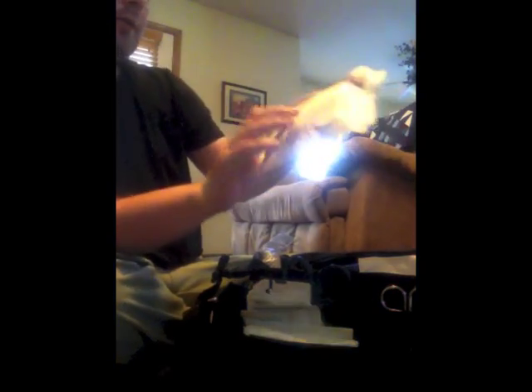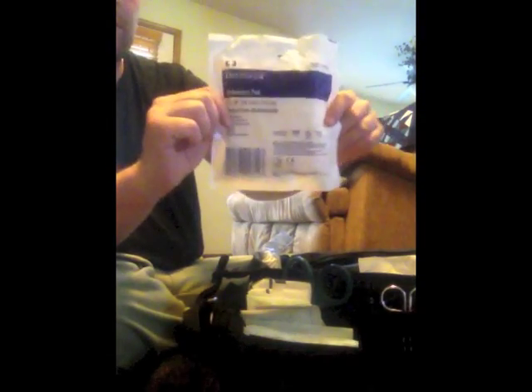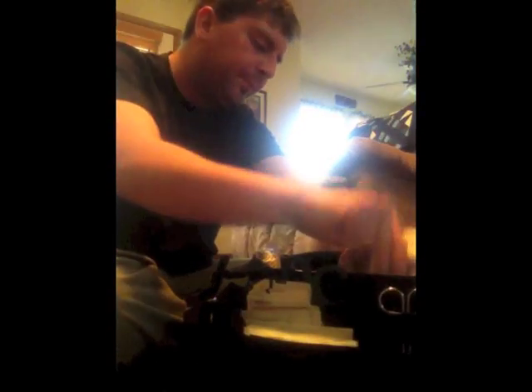Then in the front here, these are some 8x10 trauma pads. They're abdominal pads, but we call them trauma pads here. These are good for any large bleeding or anything. You can throw one of these on there, apply pressure. Then I carry two of these.